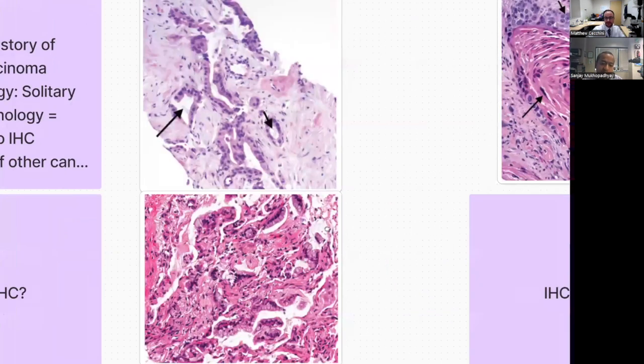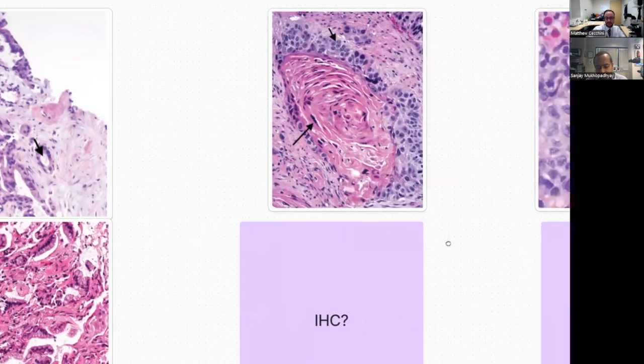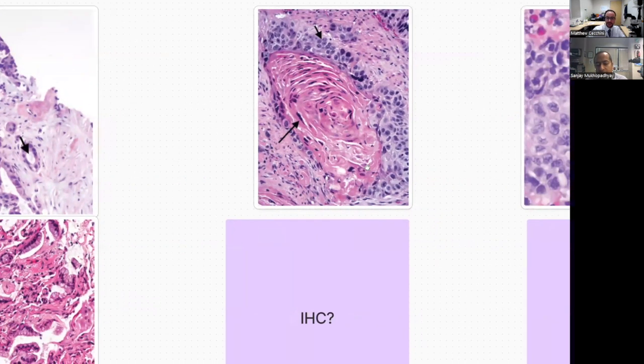Great. Okay, so let's move over to things that look kind of squamous. So you have something like this, and there's some clear squamous differentiation on histology that's got keratinization or intercellular bridges. Maybe that's not the most specific, but something that has keratinization. What do you think about that scenario? Yeah, this is the most clear-cut squamous possible. So something that has keratinization, in that case, I feel very happy to call it squamous on H&E alone.